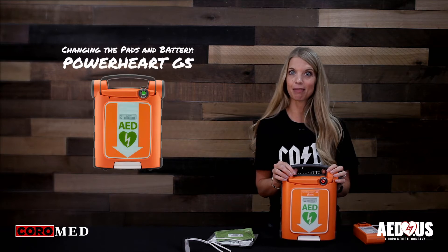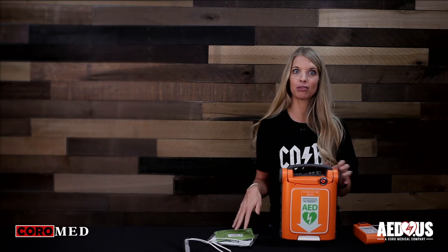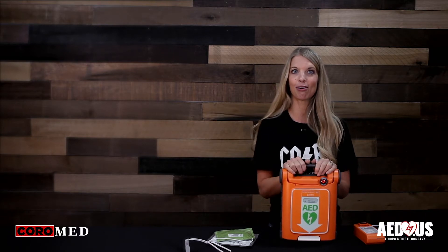This is Blair with Coro Medical, home of AED.us, and today we're going to go over how to change the pads and battery in the Cardiac Science G5 AED. To prepare for an emergency, you want to keep the electrodes and battery connected to the unit at all times.